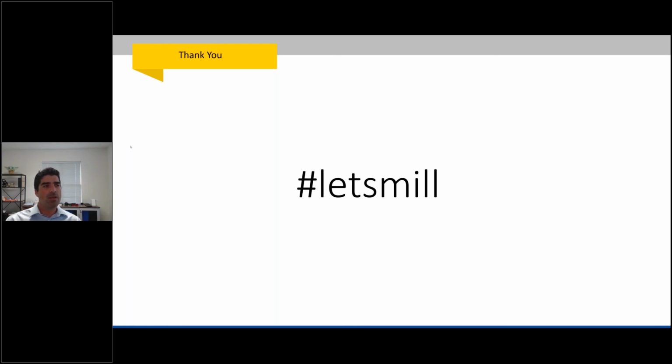You can work with Zahn support and ask them for a temporary license, and they'll walk you through that. And it's an immediate update. Then once we're done applying that change to your actual dongle, they'll come back in and let you know. So the short answer is right away, same afternoon kind of thing. Maybe I better not make promises that the Zahn Dental support team has to keep, but same day, next day, that sort of thing, if you go the temporary ID route.